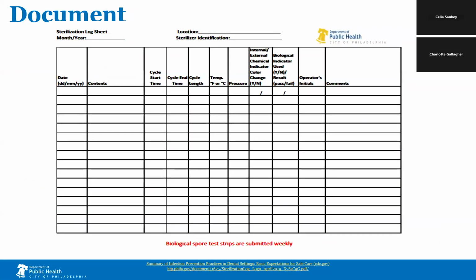Here's an example of a PDPH sterilizer log. This link connects to the log on our PDPH Health Information Portal.